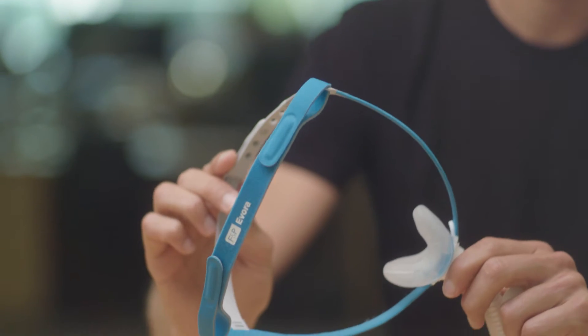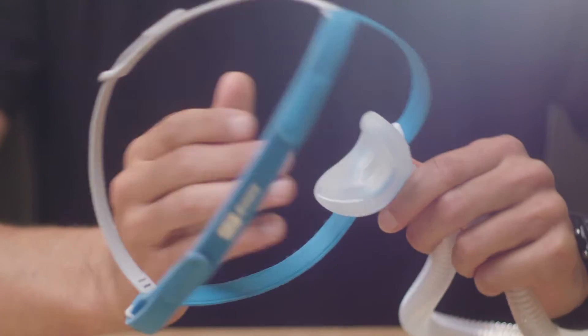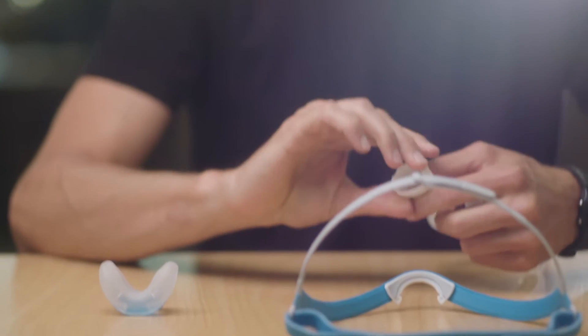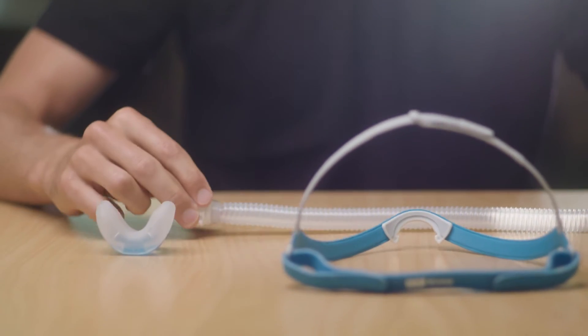What I love about Evora is the amount of technology and design that has gone in, but simplified so the user only has to really deal with three parts: a seal, a headgear, and a frame and tube. You just connect these things back together and you're good to go.